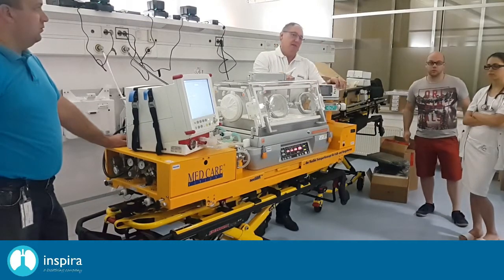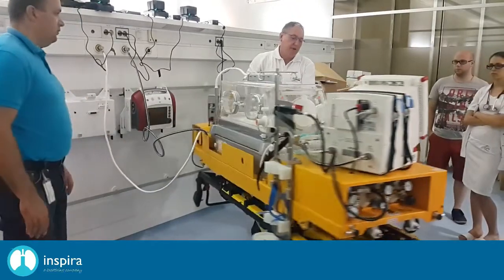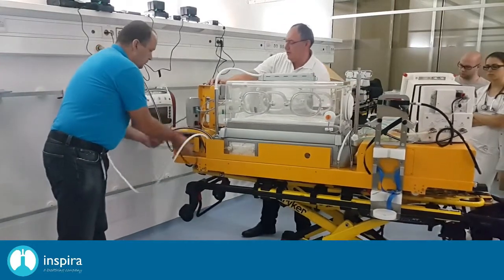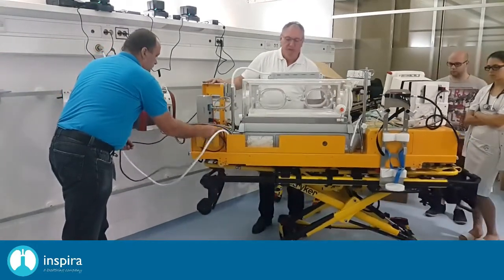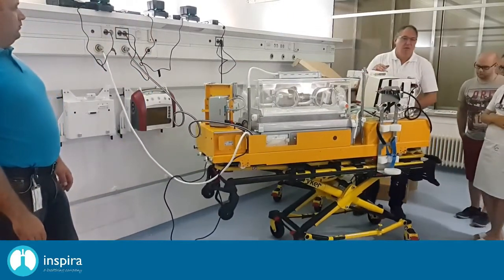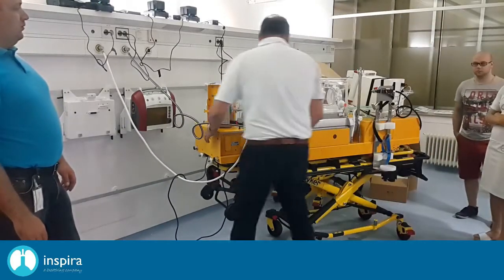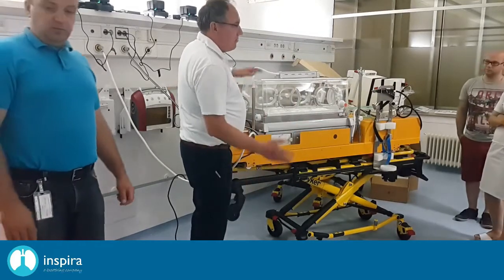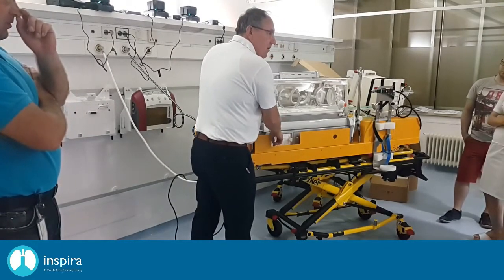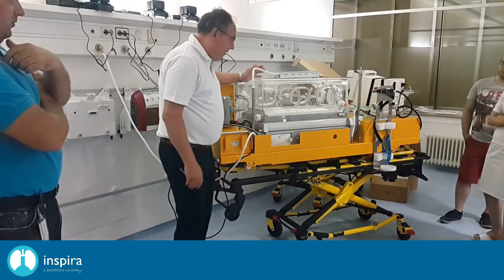Okay, on the back side of the incubator, we talk about that for a moment now. You have a filter, which is an electrostatic filter, and it has to be changed every 3 months at the latest, okay? This is this one. If it is turning gray, change it before. But in any case, it needs a mark here when you have changed it last time in order to make sure that it will be changed on a frequent basis.